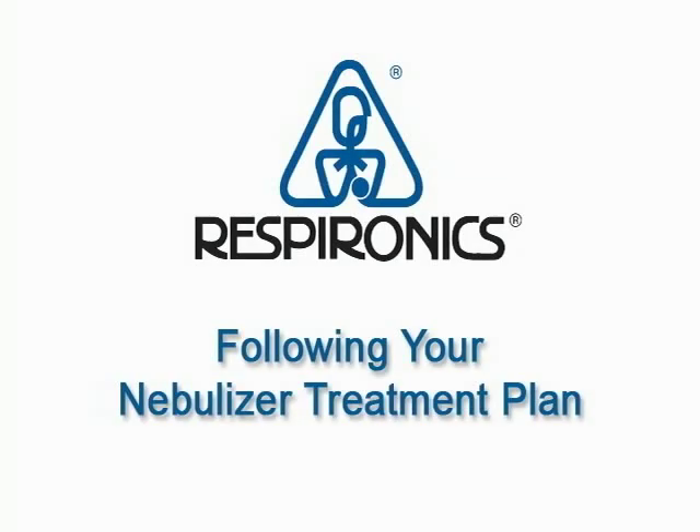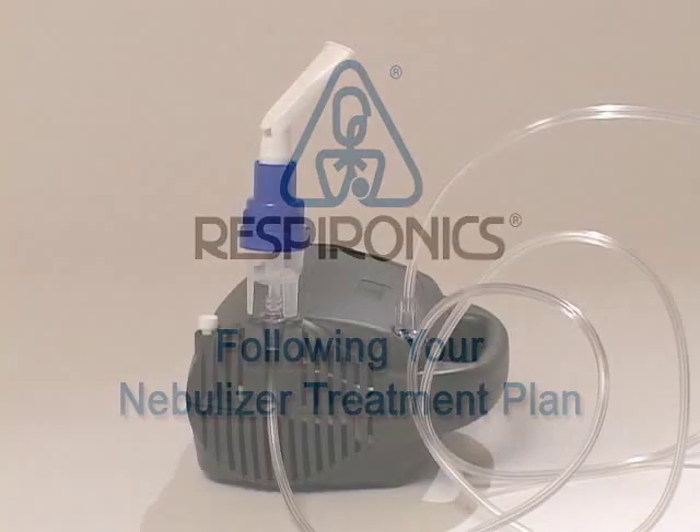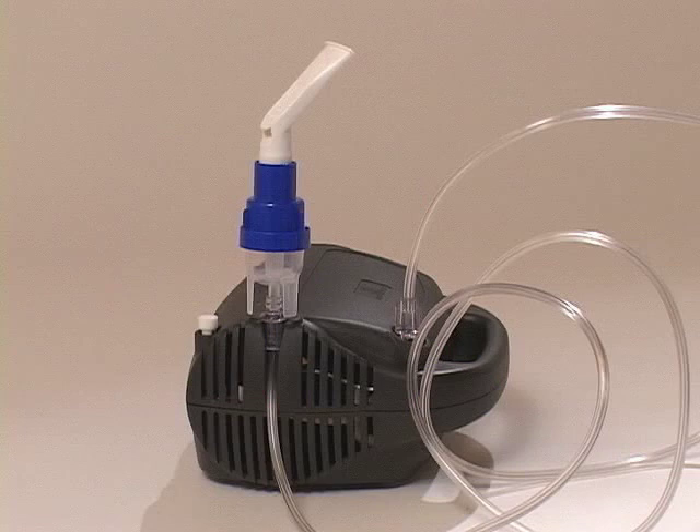Following your nebulizer treatment plan. Your doctor has recommended taking your respiratory medication with a compressor nebulizer system that allows the medication to go directly to your lungs, where it is most effective. This video will show you how to use your nebulizer system.